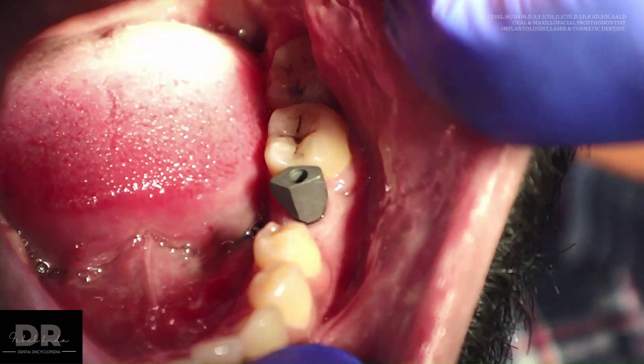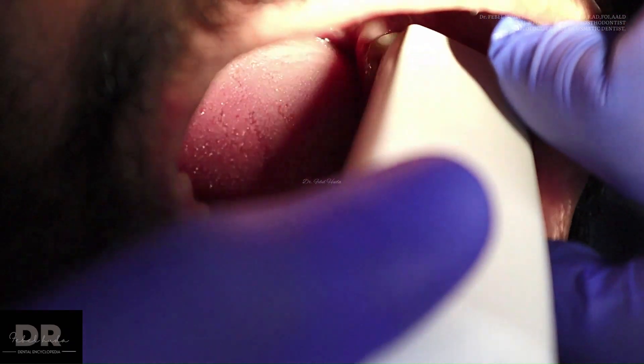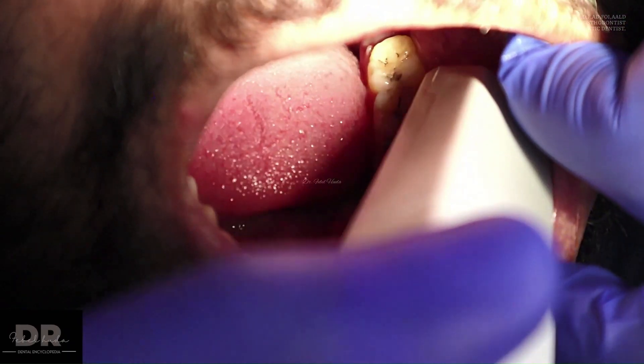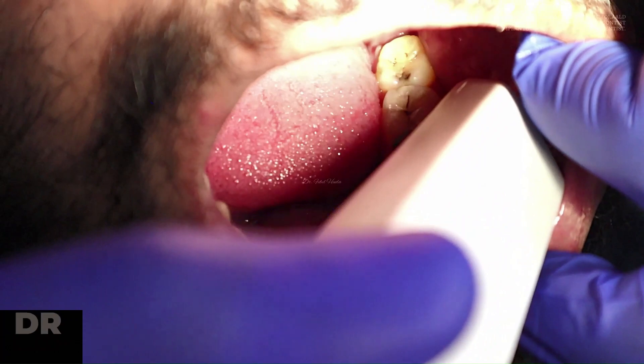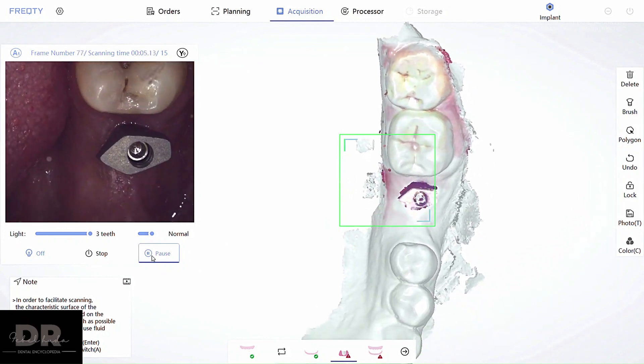You then attach the scan body. Scan bodies can come in different materials — either titanium, like the ones shown here, or PEEK. Whatever scan bodies you have, just follow the instructions provided by the specific implant company when performing the scan.